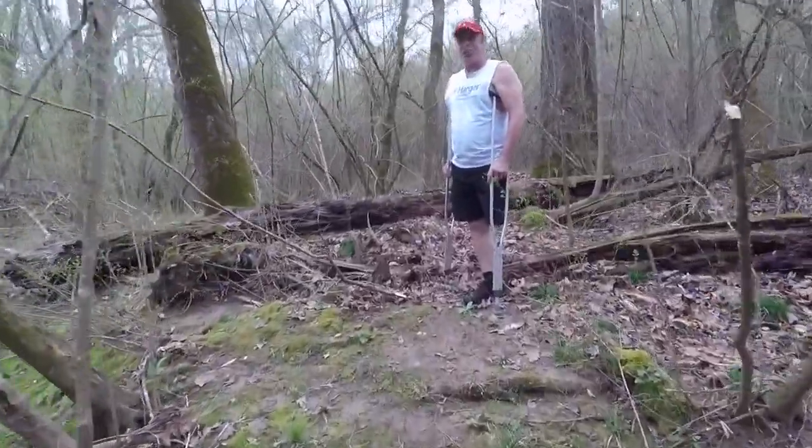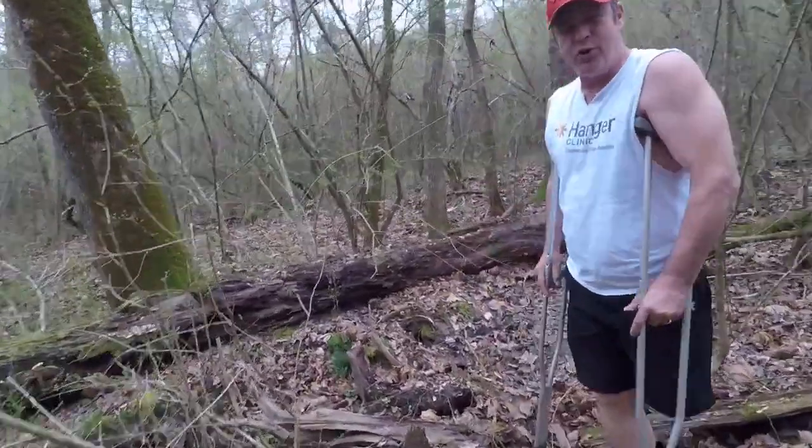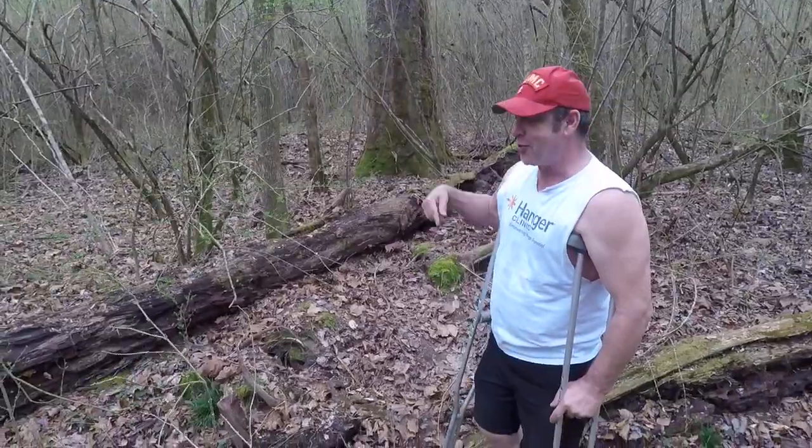Here's another good obstacle right here — a log laid down. Several ways to do it. I'm just going to show you what I would do. I've seen some of my friends who sit on it, throw their leg over and go — whatever you need.